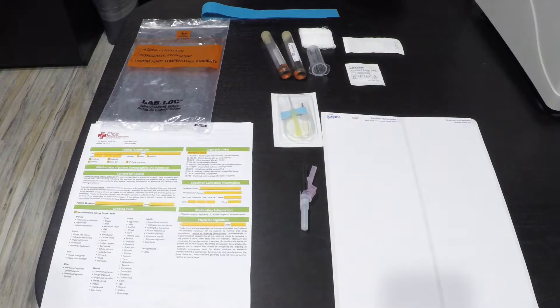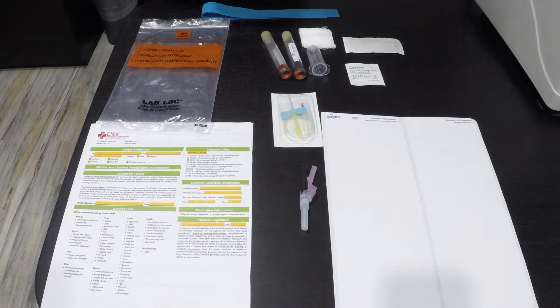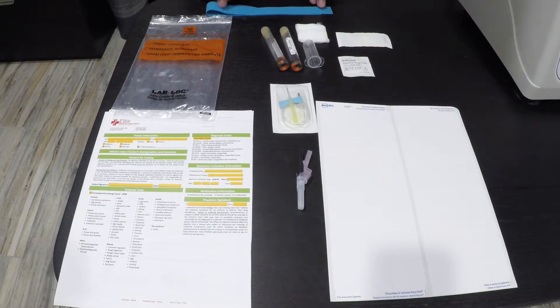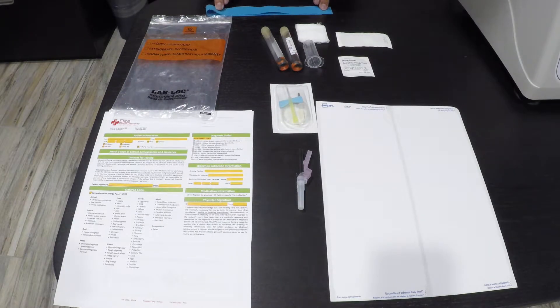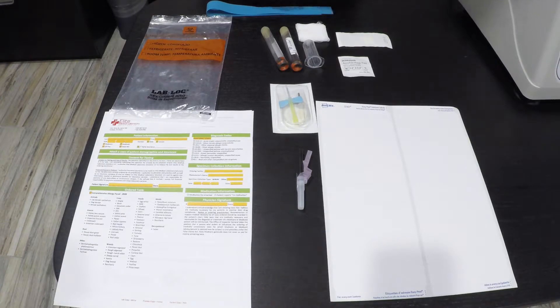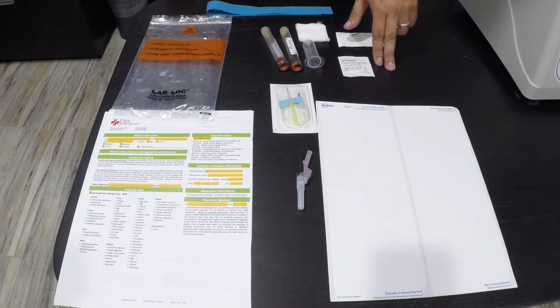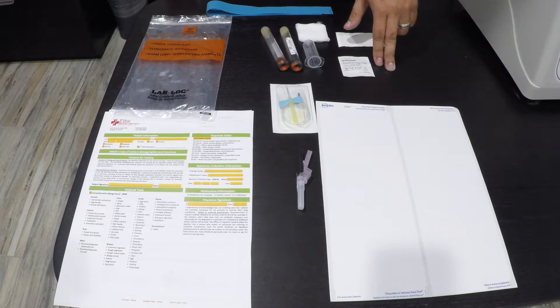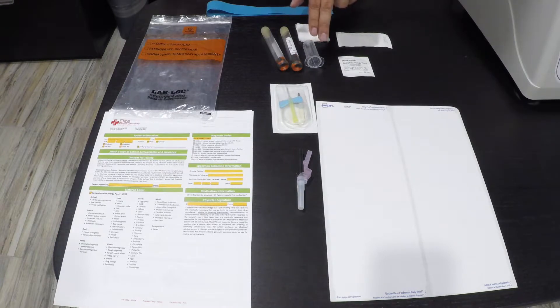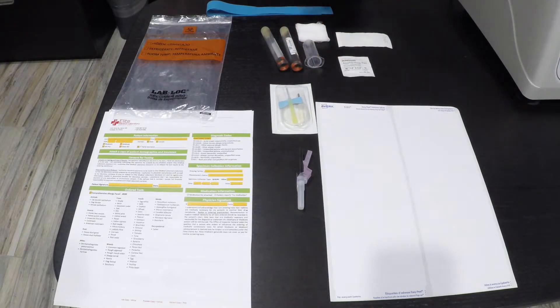We will now be going over the collection process for the comprehensive allergy panel. The MA will need a tourniquet, swab, band-aid, alcohol prep pad, and a vacutainer for the straight needle or butterfly needle.